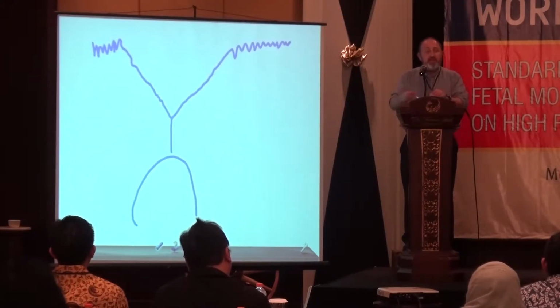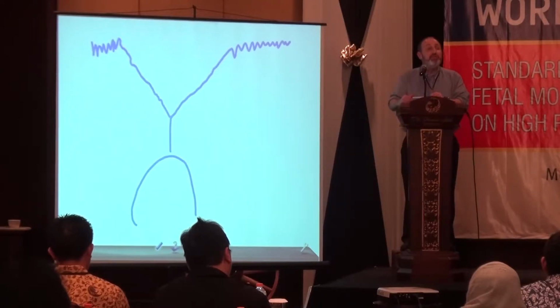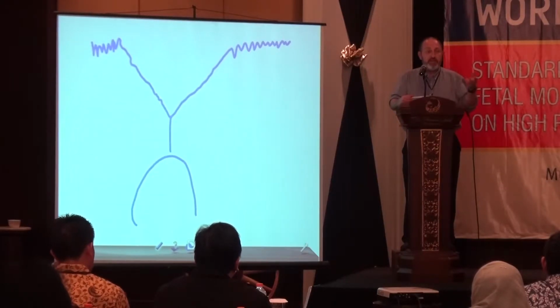So early decelerations are not associated with fetal hypoxia, they're not associated with acidosis, and they're not associated with a low Apgar score. So they are reassuring, and the classification would be reassuring. But do bear in mind the overall clinical picture. If you do have early decelerations in the absence of the fetal head being compressed, you should be alert to monitor more closely because the pattern may change.